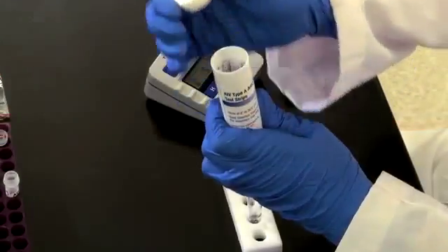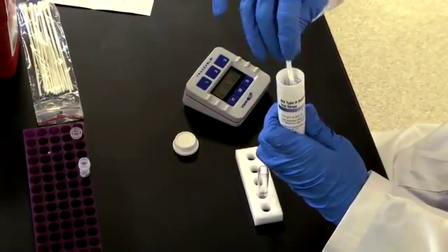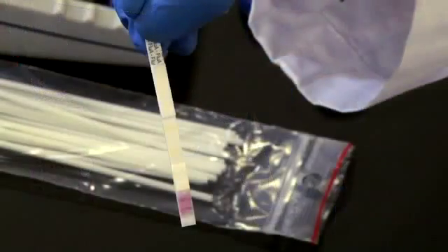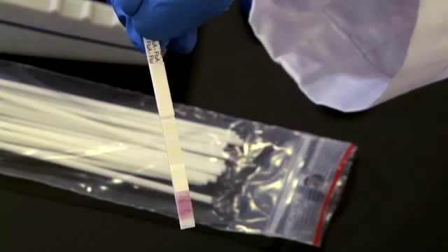To begin, remove a test strip from the desiccant vial for each sample to be tested. Handle the test strip on the labeled portion of the strip. Please note, prior to use, the test and control bands appear yellow. The bands are dyed yellow for quality control purposes. The dye does not interfere with the test results and will wash away while the test is developing.